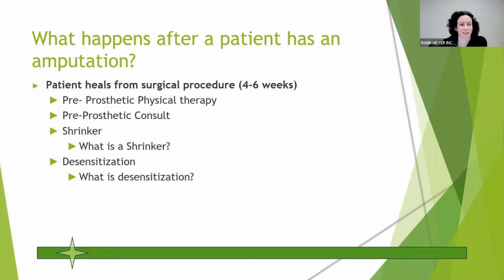If I could just add one more thing, in terms of actual components and how insurance companies qualify K4 versus K3, there's literally only one component that is a K4 component, and that's a high activity knee frame. Otherwise, someone with K3 would qualify by the insurance for the same components as K4. So it is more important that the activities are listed so that we pick the right components and be able to justify it. But great questions. Thanks, guys.